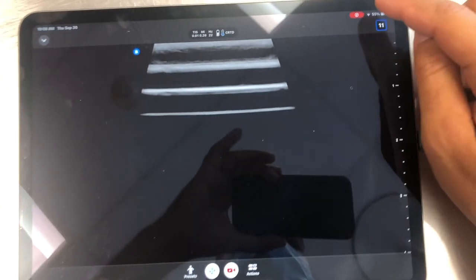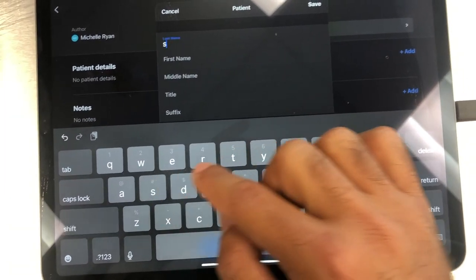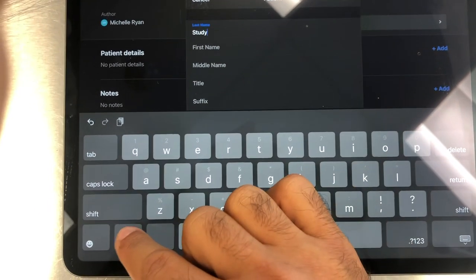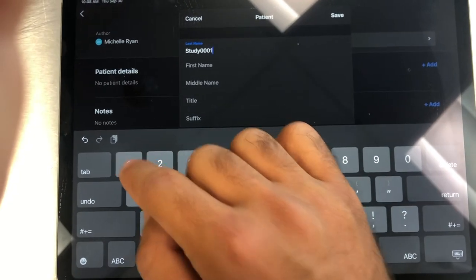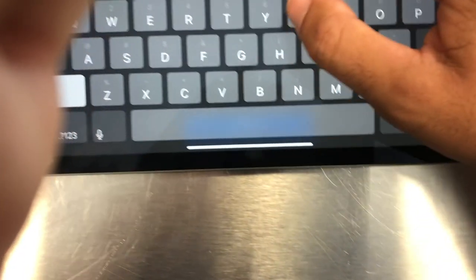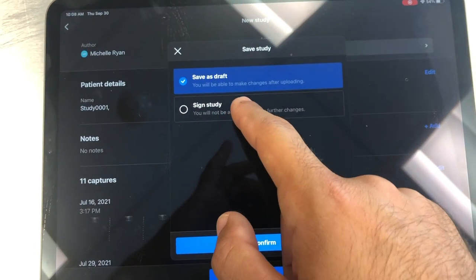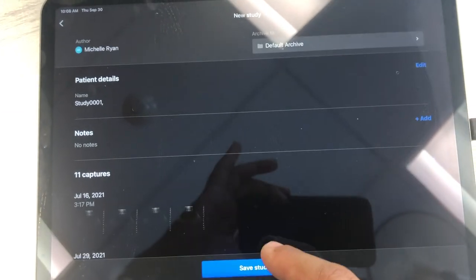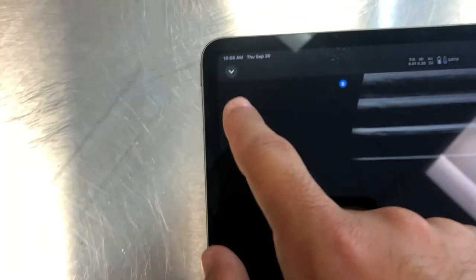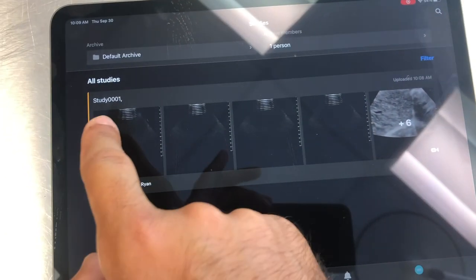When you want to save your study, go to your images and add patient details including the study ID — for example, Study 0001. With 11 captures, you can press save. The study ID 0001 with 11 captures will appear, and from there you can save your study as a draft or sign it. Your images are then saved under your archives, where you can go back and review the study.